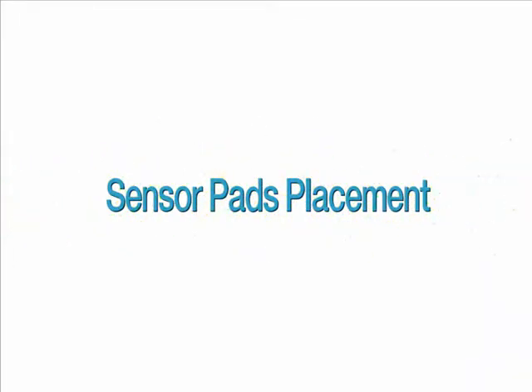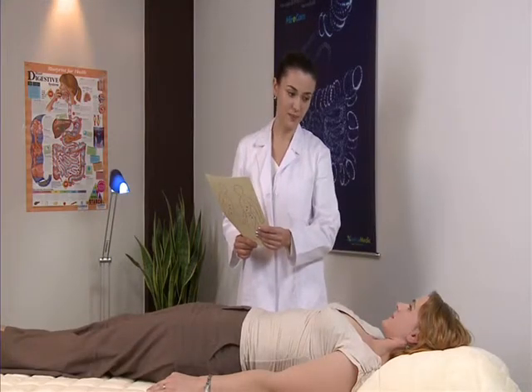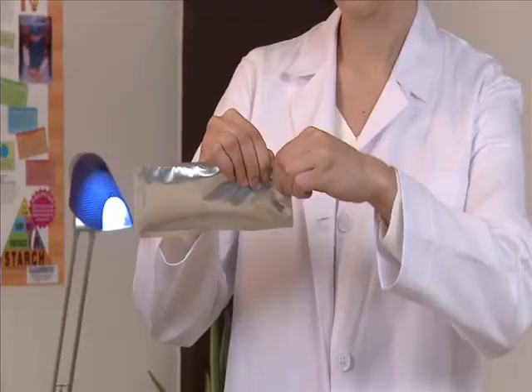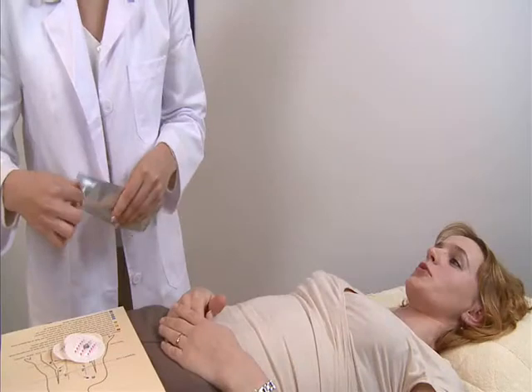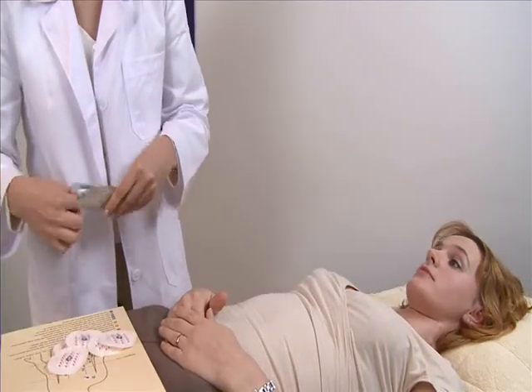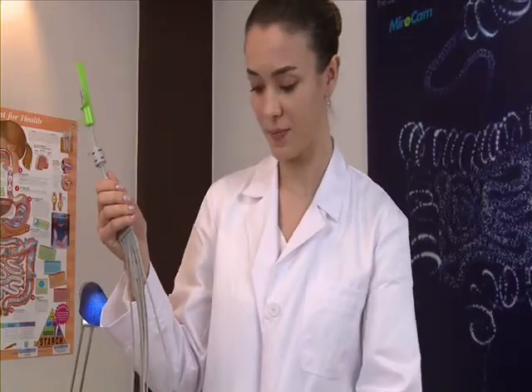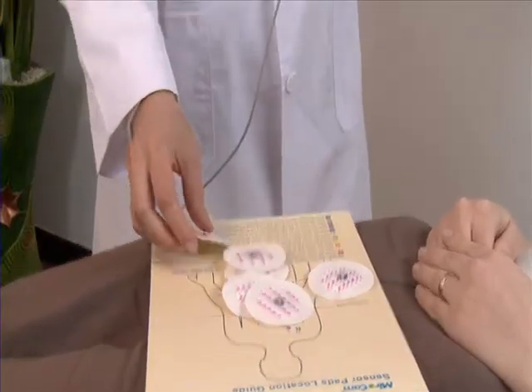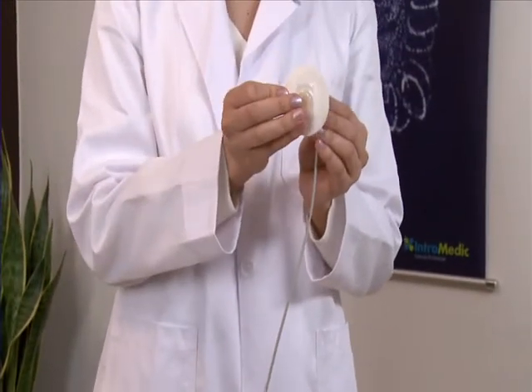Sensor Pad Placement: Describe where the sensor pads will be attached on the patient. Open the bag of sensor pads and attach the data cables prior to affixing to the patient. The patient may need to be shaved as required.